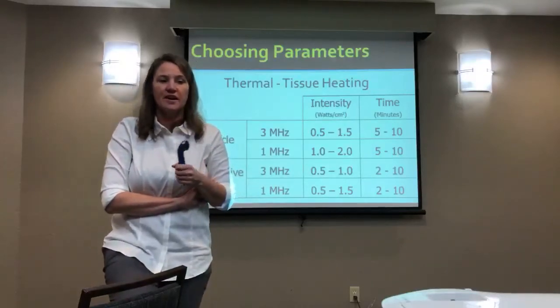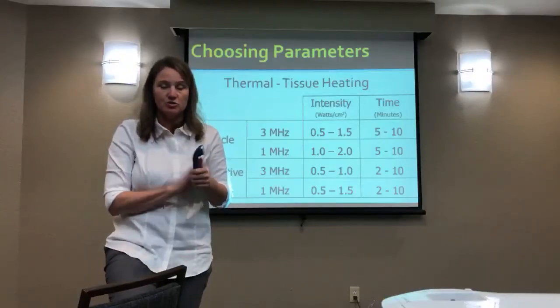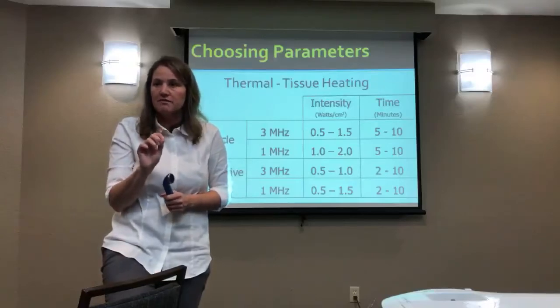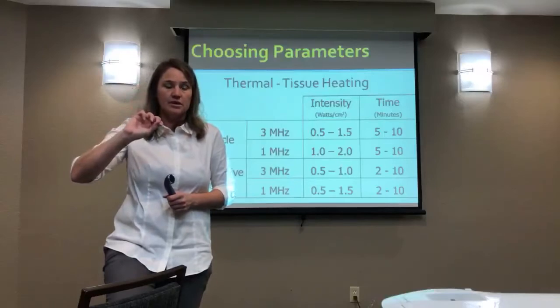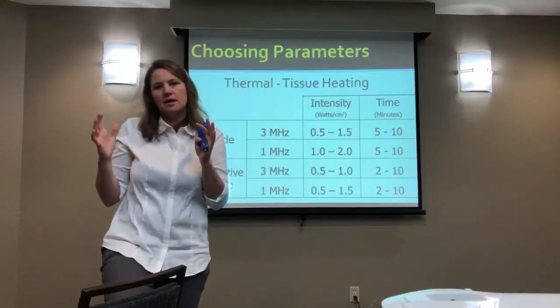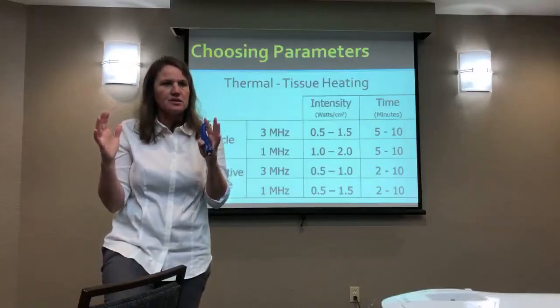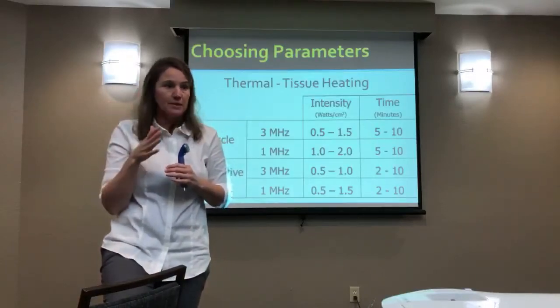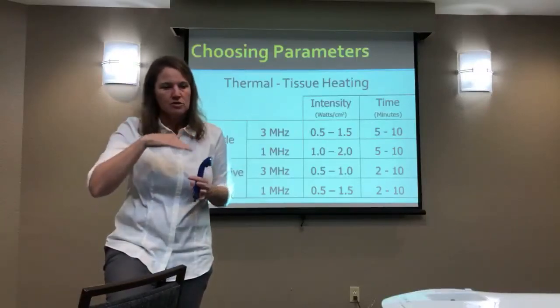And 1.5 would be very high, meaning if you do 1.5 and you're treating twice the size of your sound head, they're going to encounter some discomfort at some point, and you're going to have to go bigger or turn it down. So these are meant to be, in my mind, sort of the lower and higher numbers. Now, add into that your technique, and it's going to make a big difference. Just to go through this chart real quick and then return to a few thoughts.